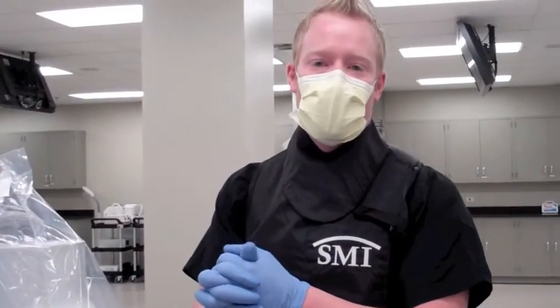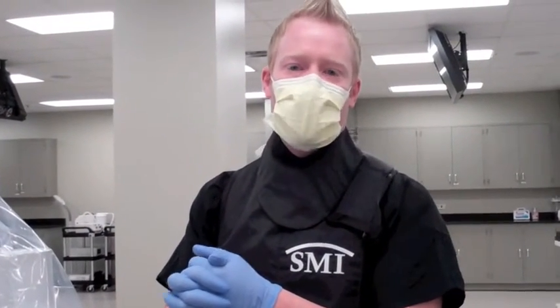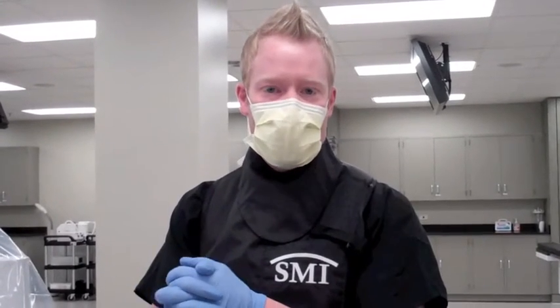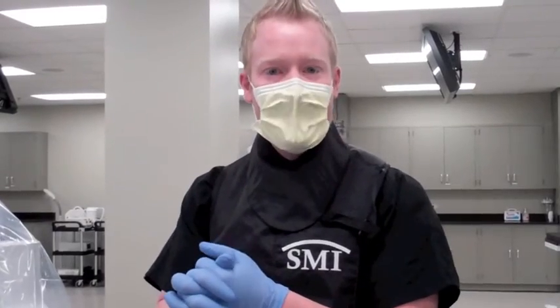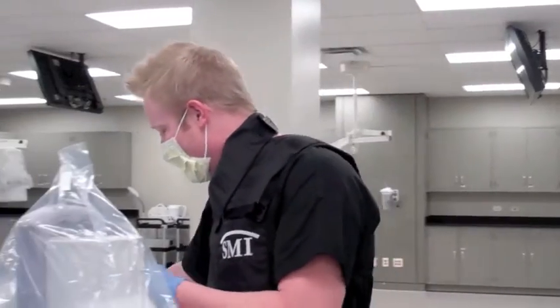Hi, I'm Dr. Paul Lynch. I'm going to walk you through a percutaneous discectomy procedure. We are using a cadaver body today, so we won't be using all the same sterile techniques that you'd normally see. But I'm going to walk you through the procedure.